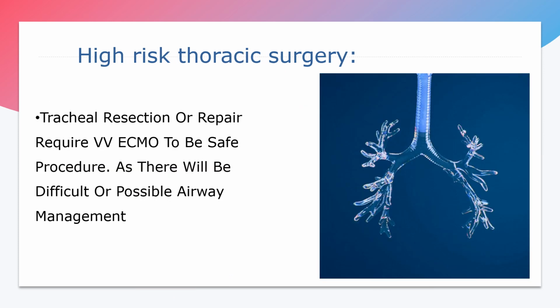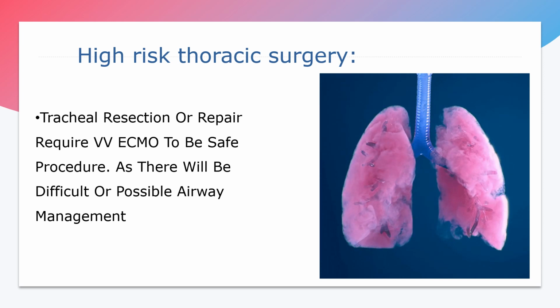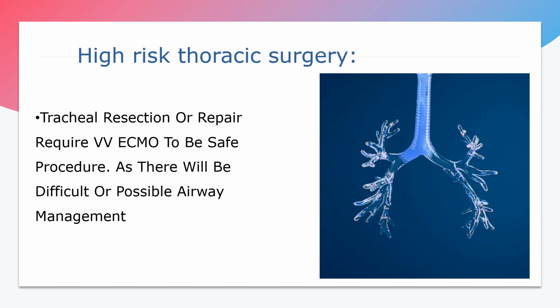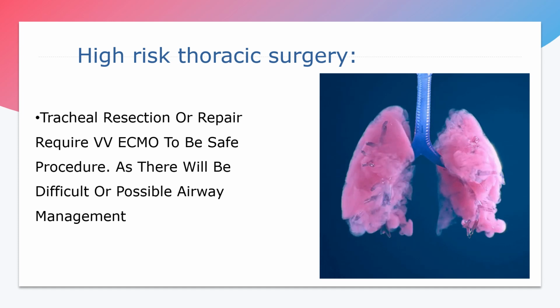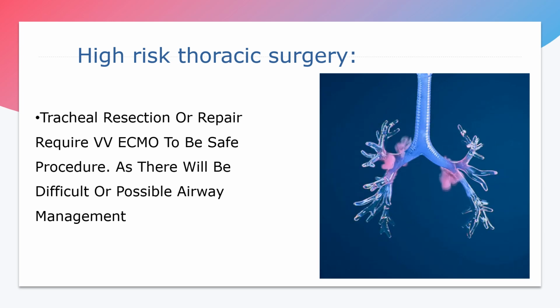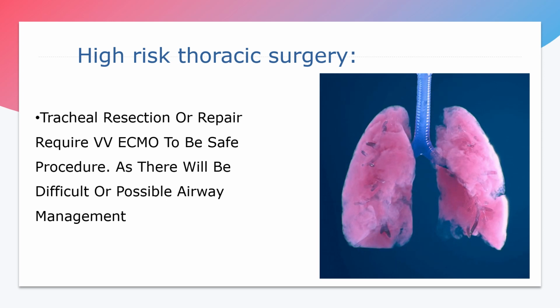Another type of surgery where ECMO is highly needed is high-risk thoracic surgery. For tracheal resection or repair, VV ECMO is required to keep the patient safe, as these patients may have difficult or impossible airway management, so ECMO will save this operation.